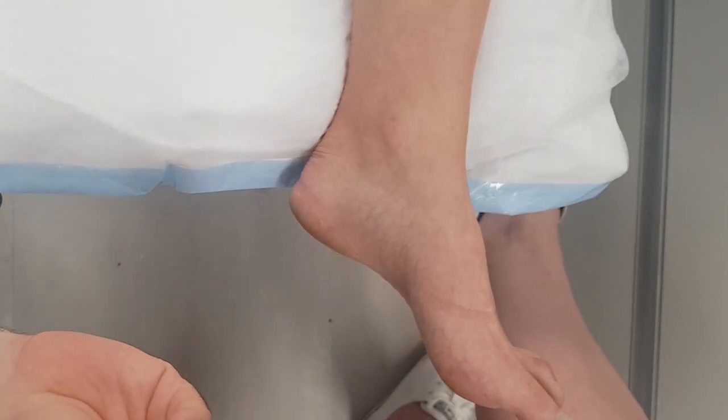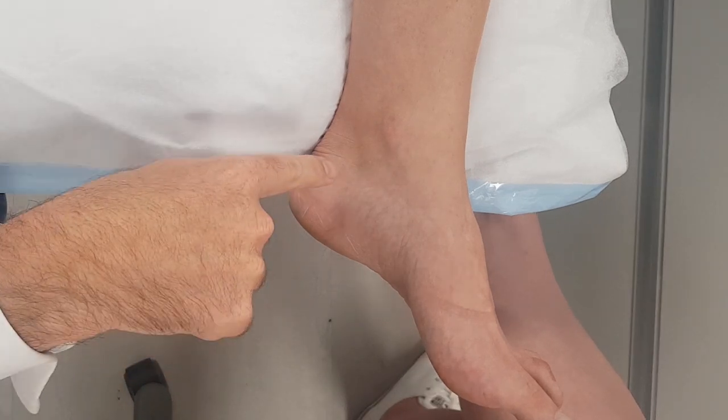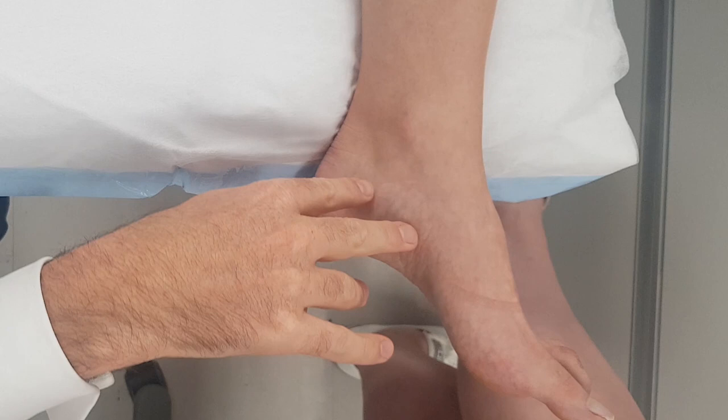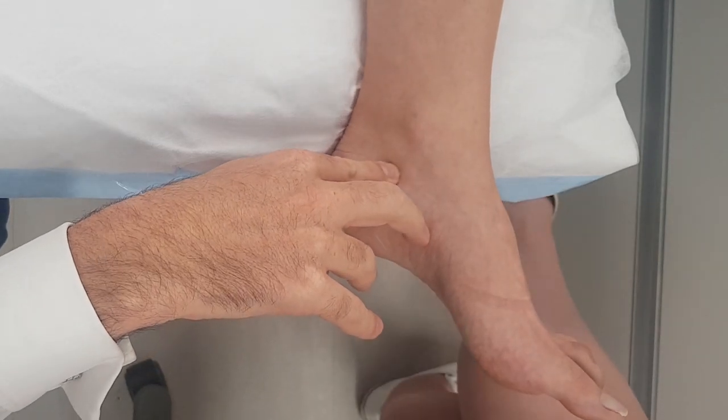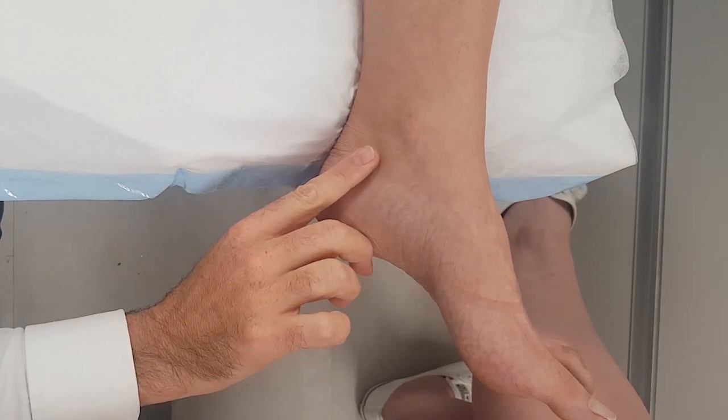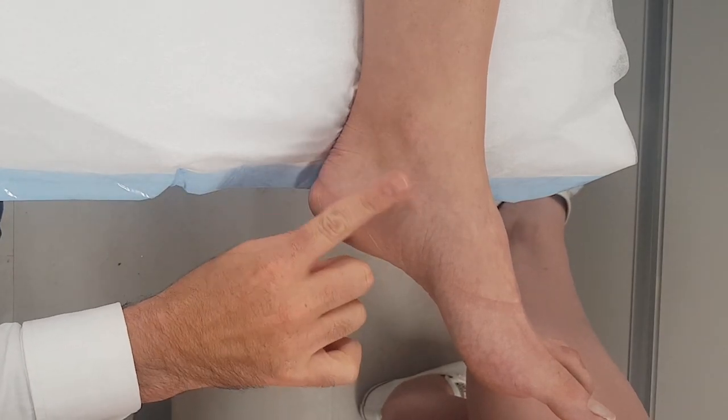If you don't feel the tingling and the burning pain, just keep going — you're going to hit the calcaneus, then draw back a little bit, and then dump it. So even if you don't get that sensation, you keep advancing until you hit the calc, draw it out a little bit, and dump it. You want to see a nice big bolus sticking out of the skin.